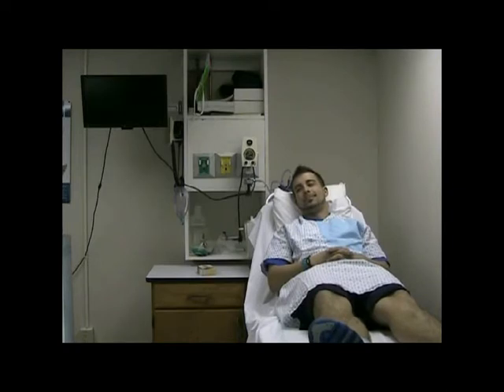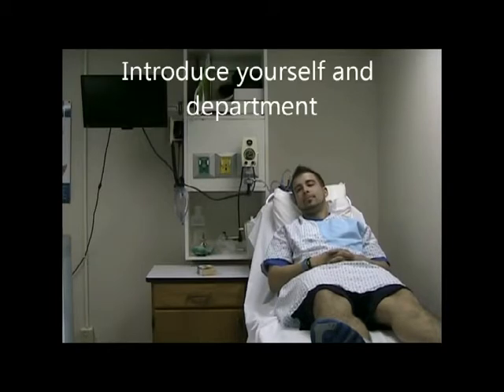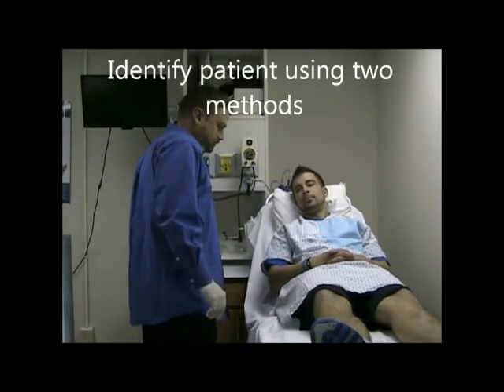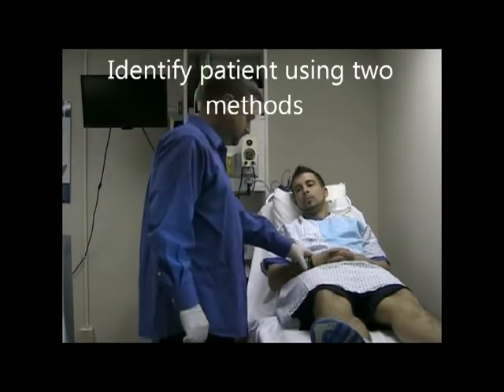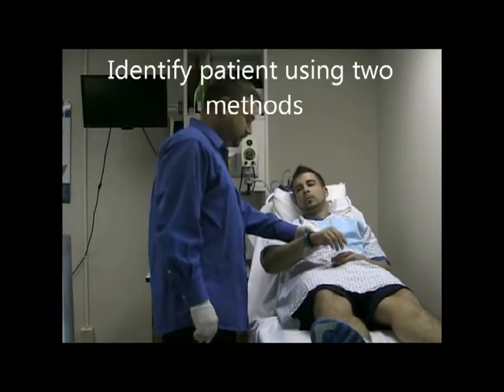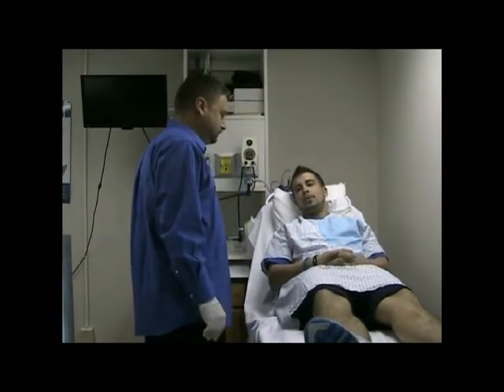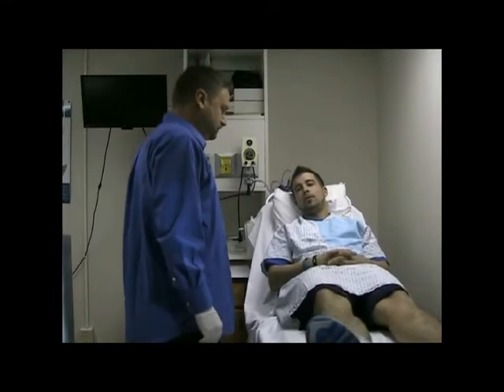This is the peak flow checkoff. After washing your hands and checking the order, you will introduce yourself: 'Hi, I'm Daryl from Respiratory.' Also, identify the patient by ID — this is Matt — and birth date. His name is Matthew Schreck, born March 21st, 1986.